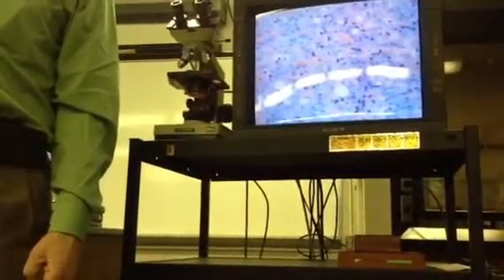You see more and more capillaries, very abundantly permeating these fascicles of cells. So that's fasciculata. That's pretty telling. Even without any other context, you can see a couple things going on here. You see these, they may be vertical, they may be horizontal, depending on the orientation of the tissue. You three, can you see anything from back there? Yes? Sure? Okay, you have better eyes than I do.